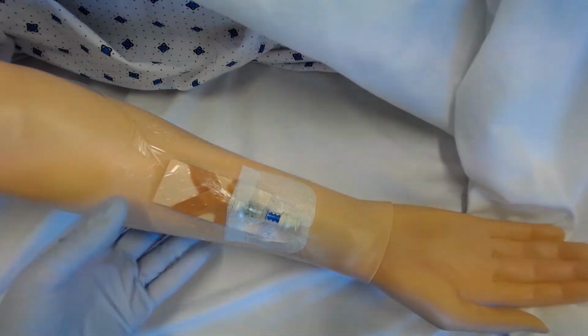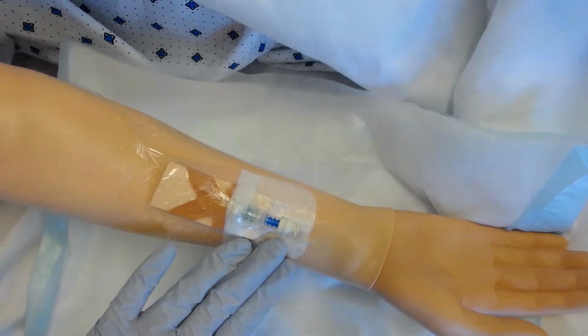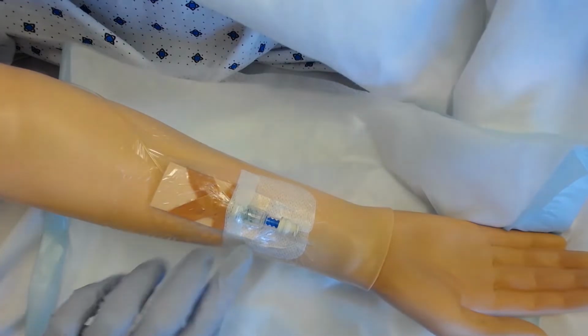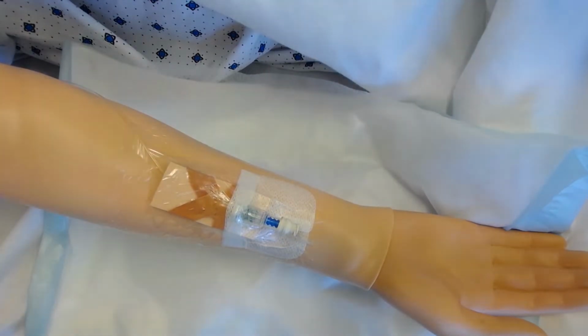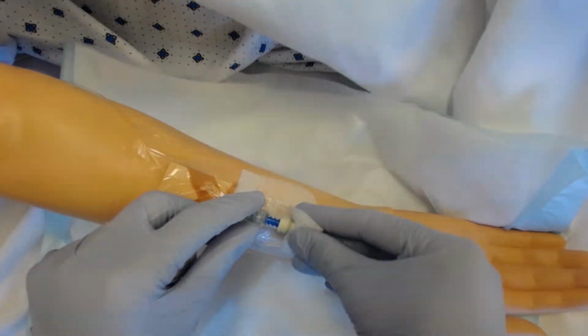So I'm placing underneath the patient's cannula site or limb a bluey, so that in case there's any fluid leaks, it won't soil the bed linen. I'm just gently palpating around the site, and you would ask the patient if it's tender, and you would be feeling for any localized warmth, coolness, and inspecting the site to see if there's any swelling or redness.